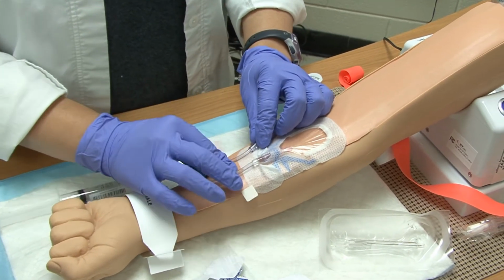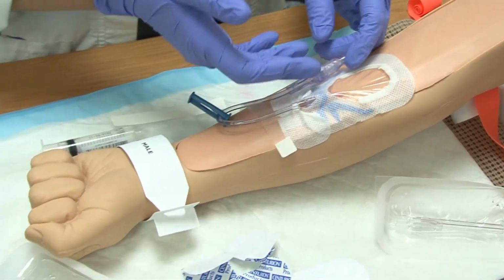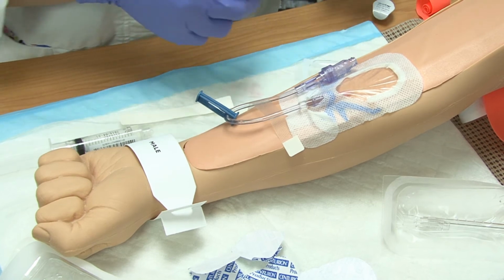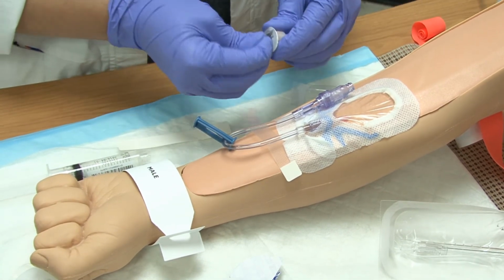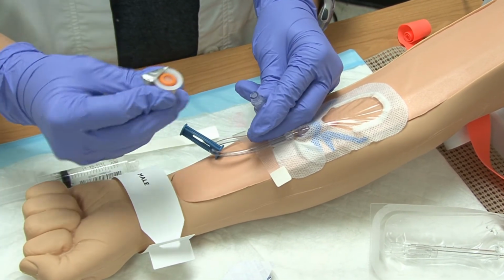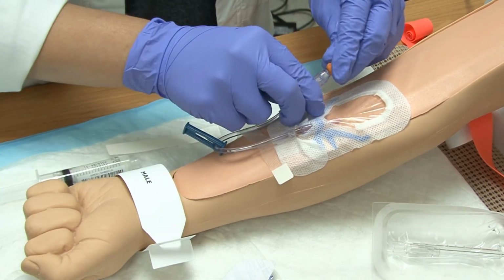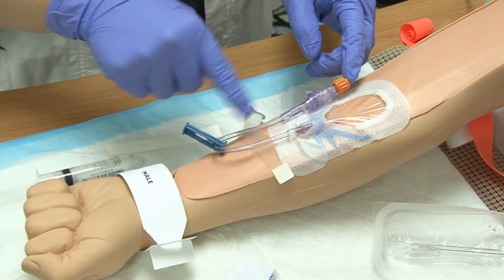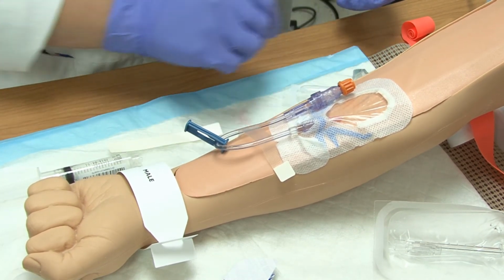And you'll see different ways for how this is done. You may see that they'll secure it down the arm and tape it. You may see that they'll kind of do it in a loop and put it up here. And at this point would be when you would come and you would take the swab cap and open this up, and don't touch this here. Come into this piece here, and it actually just pushes directly on here. And the swab cap will sit here on the end of the actual saline lock, and it's impregnated with alcohol, and thus it helps prevent infections.